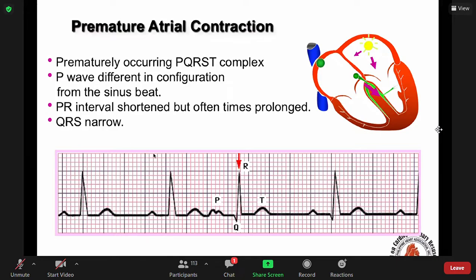and then if you look at this beat, dapat kasi yung next beat should have been about here, if I have to approximate, dito siya. Pero this beat is earlier than expected. There's a P, QRST, but if you look at the P wave here, it's bizarre looking, parang kakaiba siya, parang bifid siya, dalawa. It means to say, hindi siya galing sa SA node.